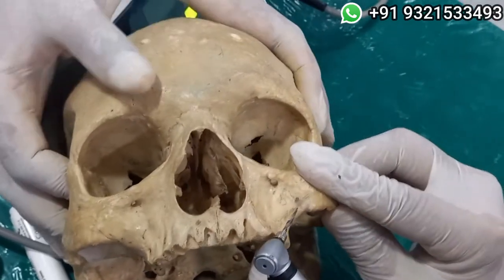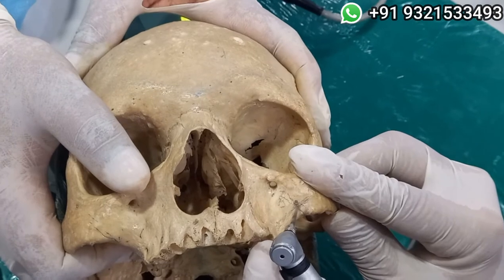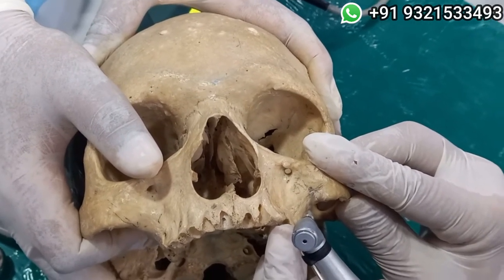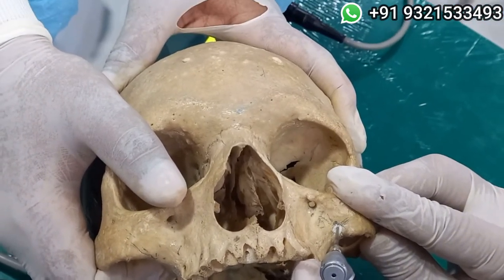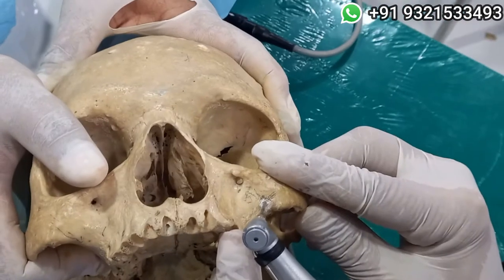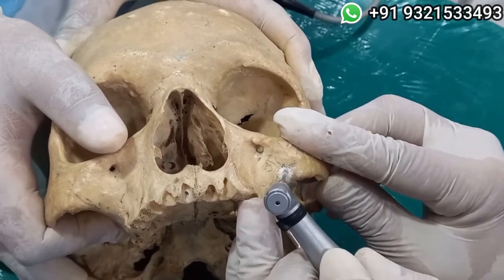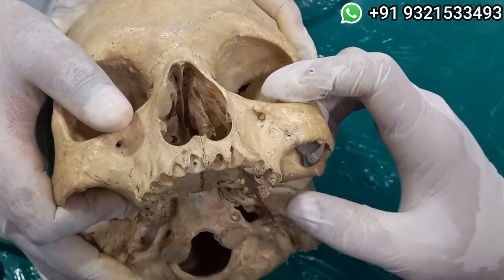So the first thing we do, to create the tunnel, is take this drill and just enter the zygomatic bone here. Okay. Here. Done. That's it. I have made an entry. Okay. I made the entry.